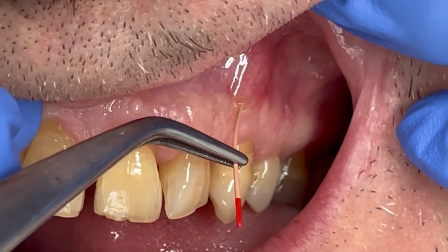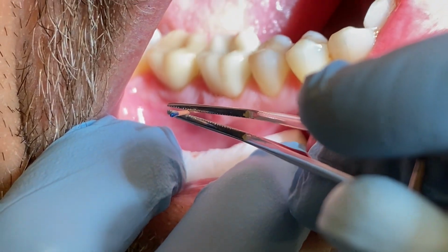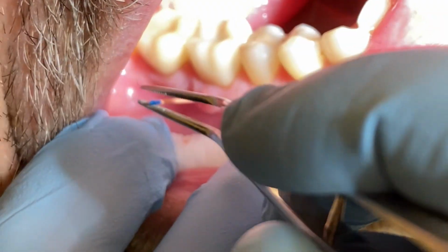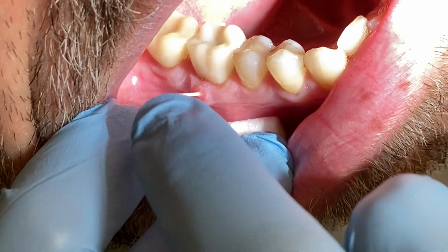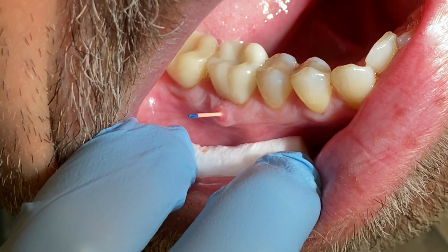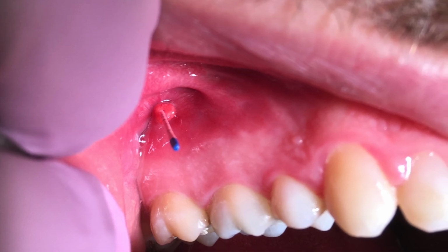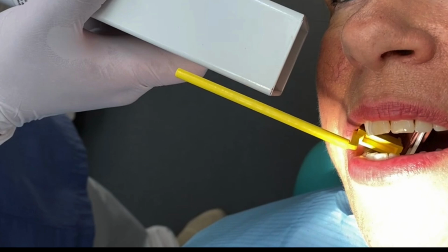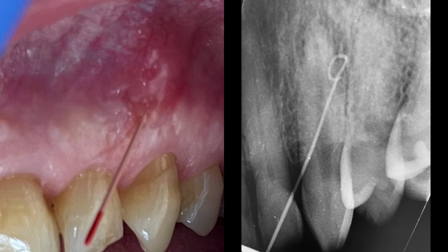Once you have selected the correct size of gutta percha point, carefully insert it into the opening of a sinus tract. Be sure to inform the patient of possible discomfort. Continue to insert the point until you meet resistance. Now, take a periapical radiograph. Here you can see how the inserted gutta percha point leads to a periapical lesion. The small size of the gutta percha point allows it to curl slightly at the end, confirming where the source of the infection is.